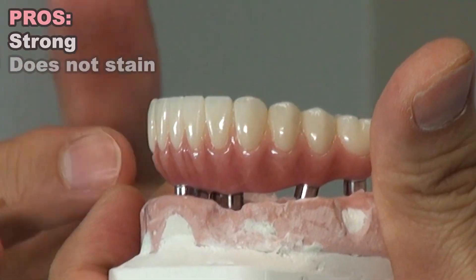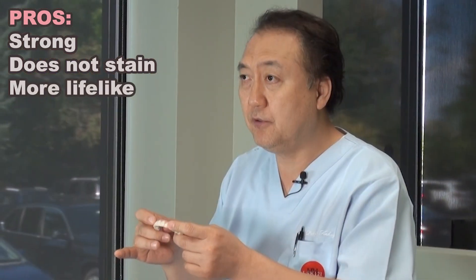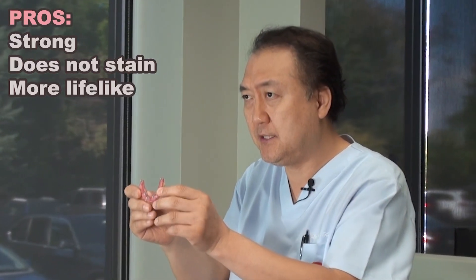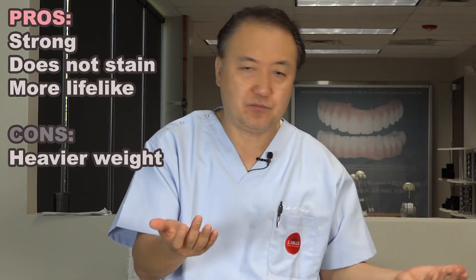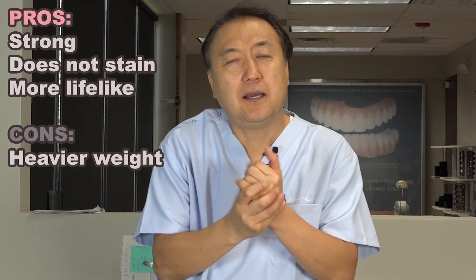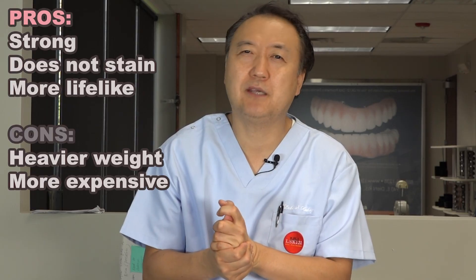On top is all ceramic — absolutely no stain, beautiful, just like natural teeth. Even brushing is fine, and underneath has exceptional hygiene. The cons: it's a little heavier, probably three to four times heavier than acrylic. Price-wise, I would say $4,000 to $8,000 depending on the laboratory skill level.